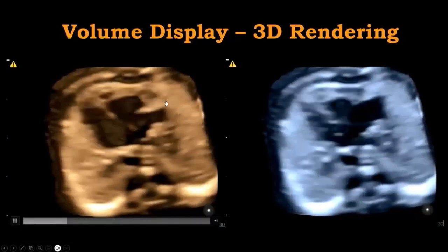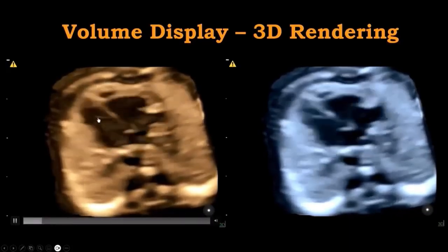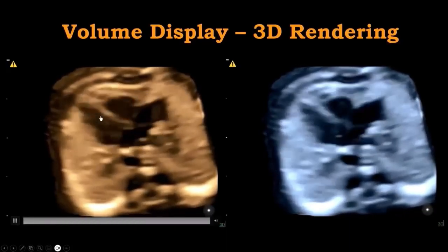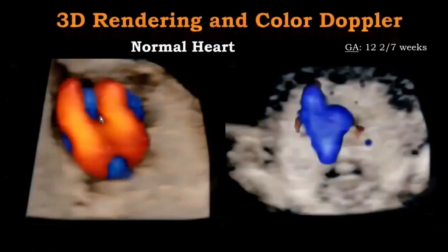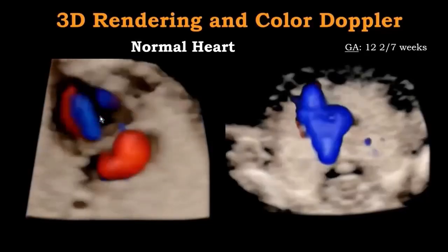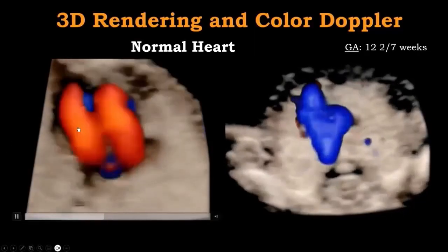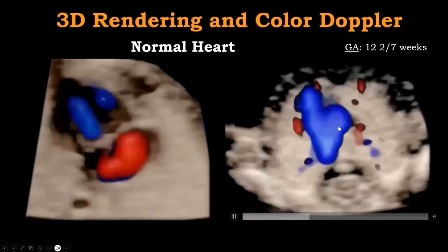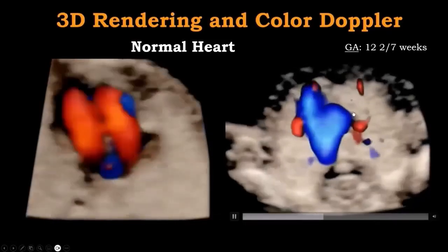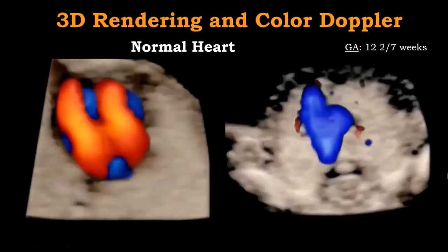And we can see teeny tiny details. This is the fetus at 12 weeks gestation. We can see even the false tendon in the left ventricle. So the resolution is really great. Here, utilizing the color Doppler together with the 3D rendering, we can see the four-chamber view, we can recognize all anatomical structures of the three-vessel and trachea view together with the internal thoracic arteries as well.